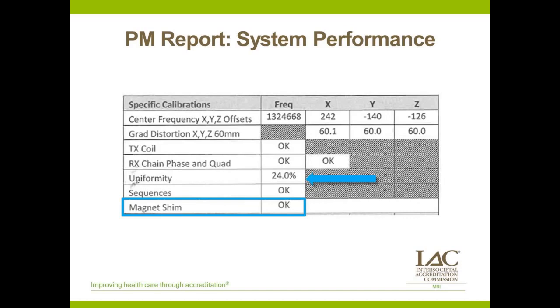And there's an additional wrinkle here that depending on how you're calculating uniformity, in some circumstances, a uniformity of 100% is considered perfect, and in other circumstances, a uniformity number of 0% is considered perfect. So from this sheet right here, I can't tell which situation we're looking at. I don't know if 24% is close to 0 on the good side or far from 100 on the good side. So a specification is needed here to be able to tell whether this is a good number or not.